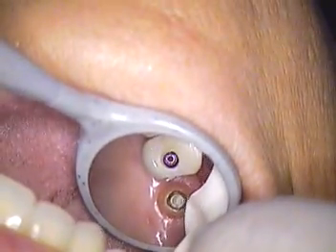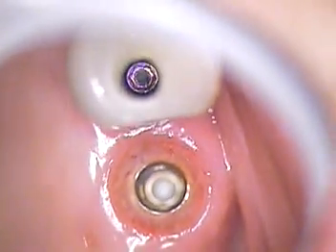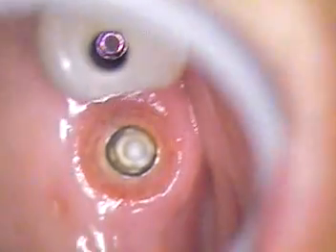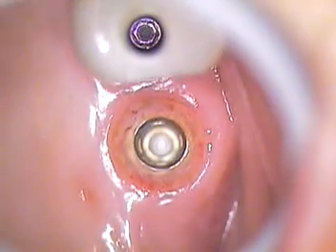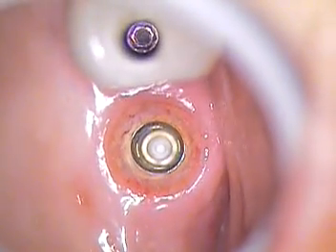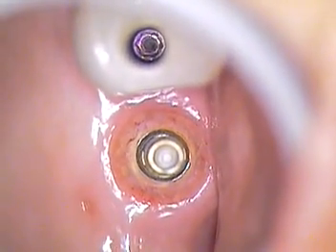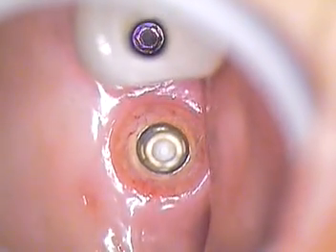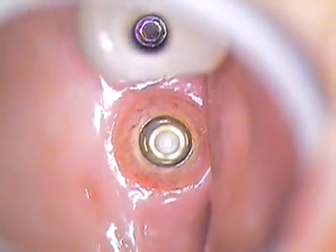Over time, but that's no problem, because these are screw retained. We can easily take them out if we wanted to, fix them, put them back in. That's the beauty of non-cementing the cases. And also the tissue likes it better. Who wants to clean cement below the gum line? My gosh, it would be a nightmare to try to do that. On earlier videos we did show you the right technique, but even with the microscope, it's a challenge. It's not that easy.